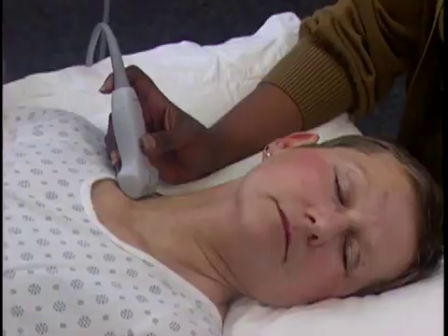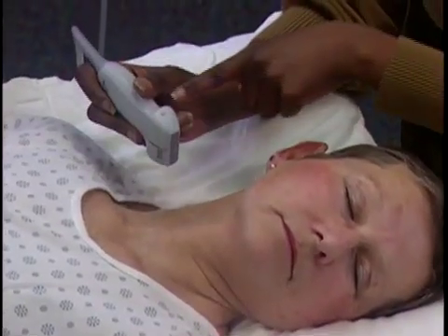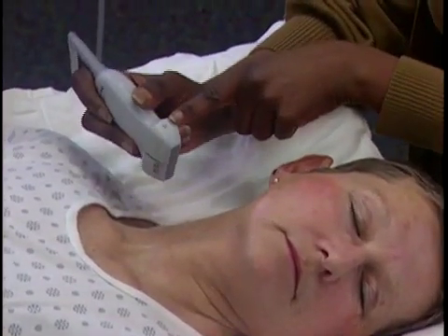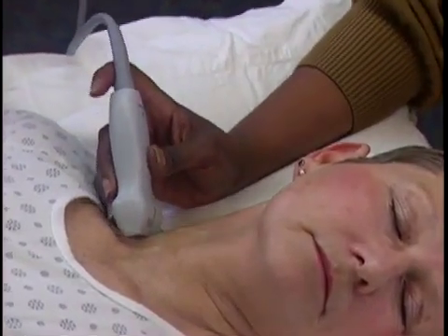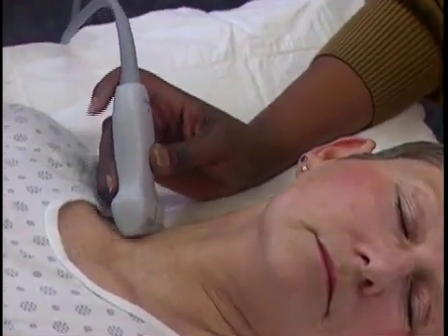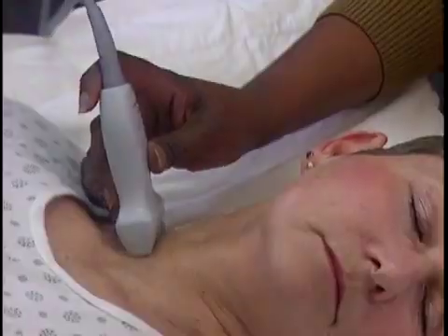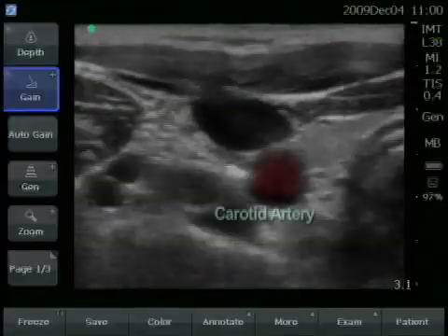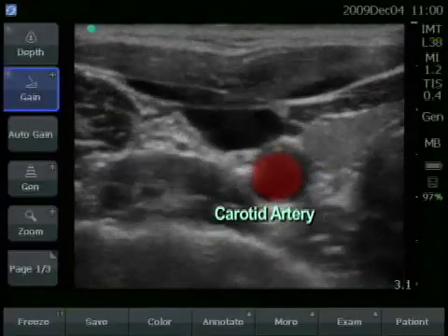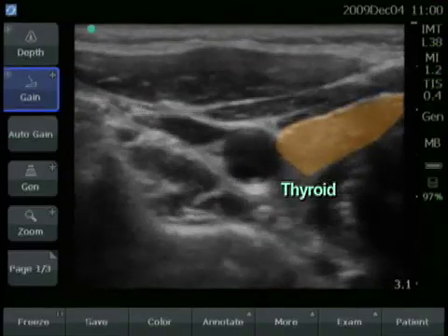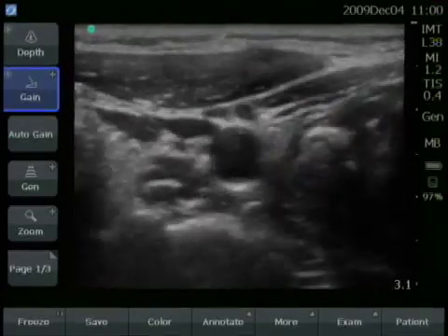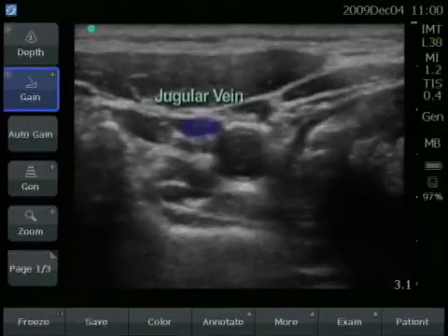We like to start this exam with a transverse orientation. You want to start low in the neck with the orientation marker facing toward the patient's back, down toward the bed. Scan up the neck in a transverse orientation. The vessel should be nice and round, and you'll be able to see the carotid artery, the thyroid gland, and often times the jugular vein.